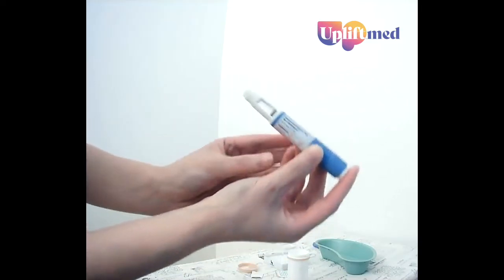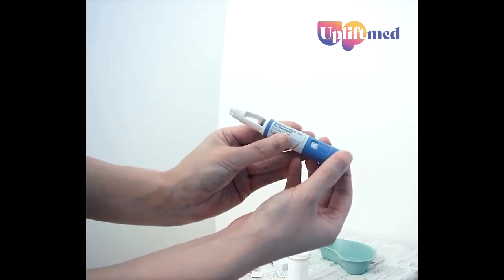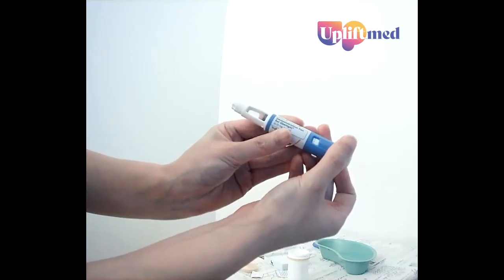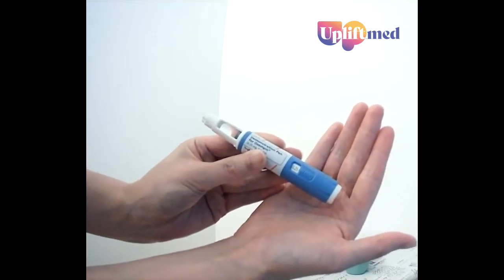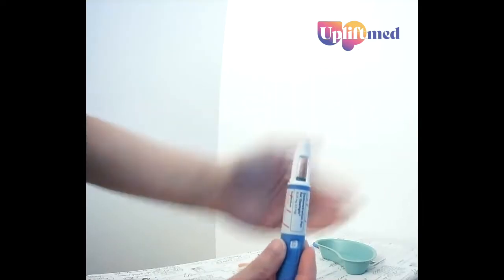Now we're going to dial up to 0.25 milligrams where it's marked. You can also see that another drop of fluid is starting to show.